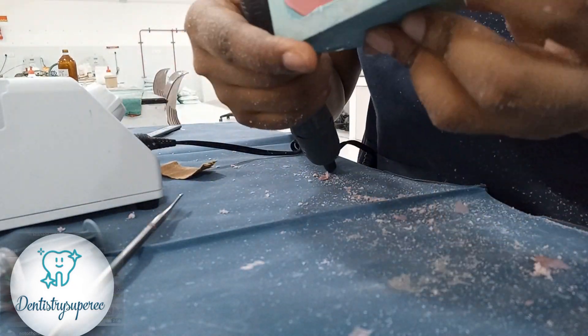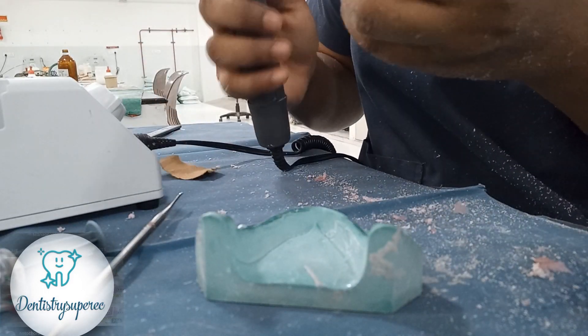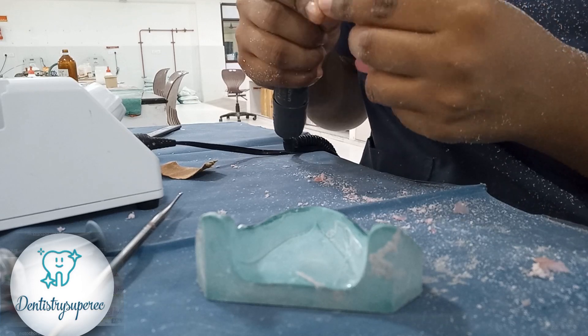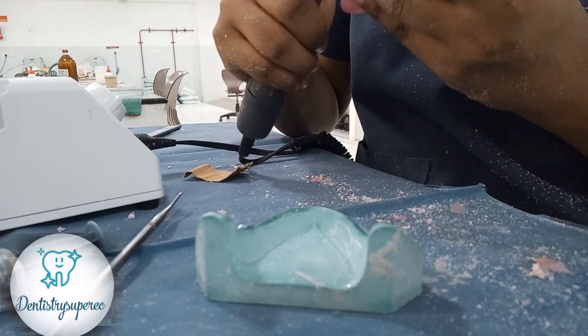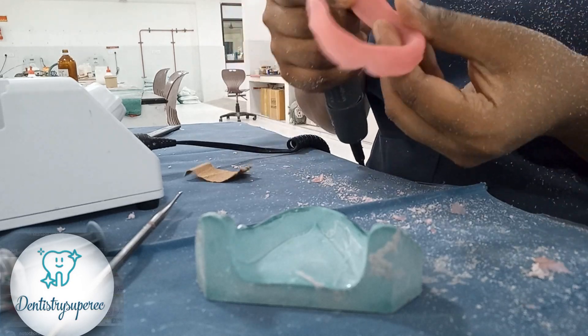Once done, polish with your acrylic polishing burs and sandpaper — it should be done through all the grit sizes of sandpaper to get a very smooth finish. Since I didn't have all the sandpaper grit sizes available, I didn't complete all steps here.